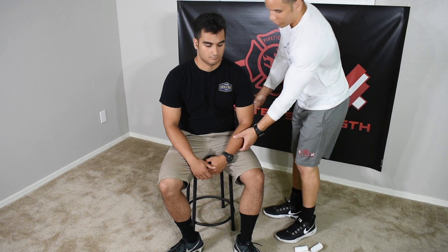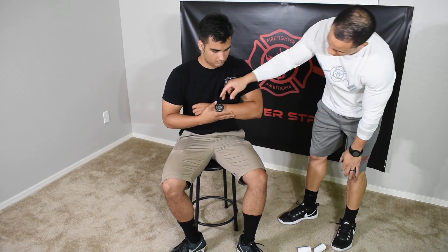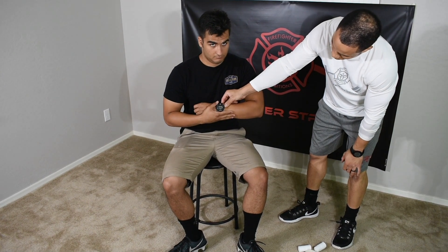BSI, scene safety. Sir, I'm going to have you hold this and stabilize it here. Maintain that for me. I'm going to assess for CMS. CMS functions are present and normal.